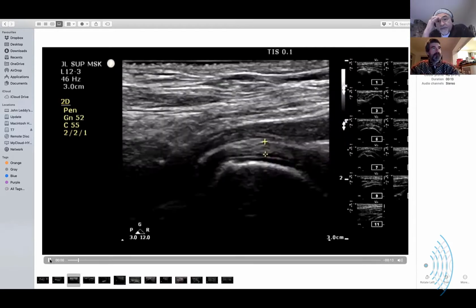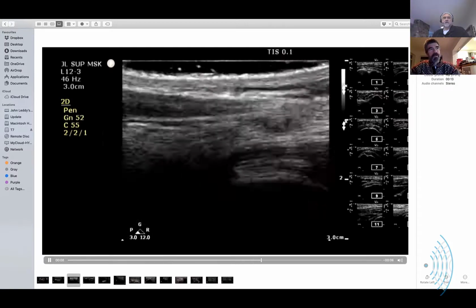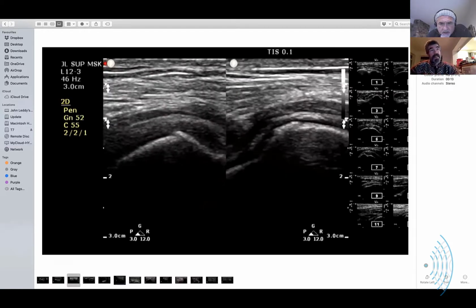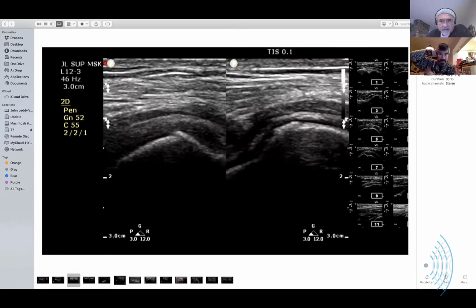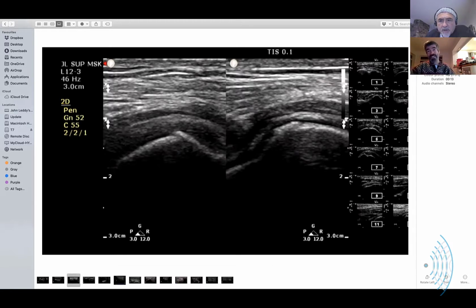So then talk me through this again. This is part of diagnosing adhesive capsulitis. Is that what you're doing? Yeah. If I don't see any thickening on the coracohumeral ligament, then I have a look. If they can get their arm up high enough to be able to touch there, then you can usually get to see the underside of the thing. And then that's the capsule there, and this is it here, and you just see that thicker than this, and you go, I think that's a frozen joint. I think that makes the call.